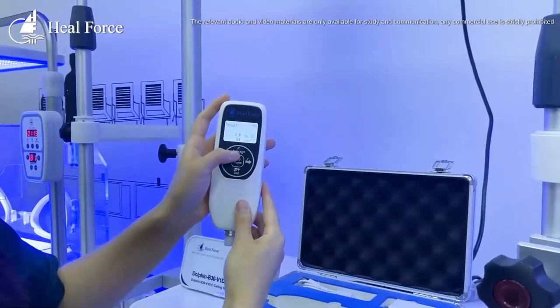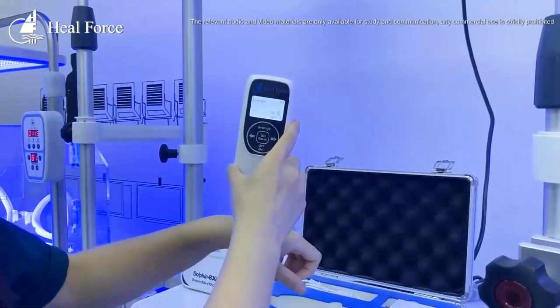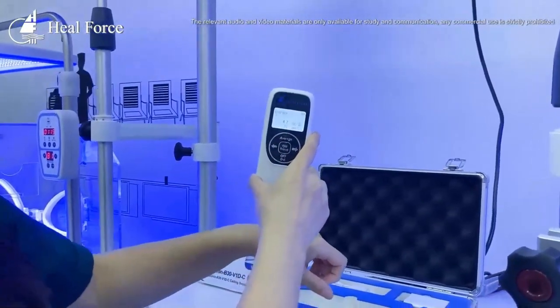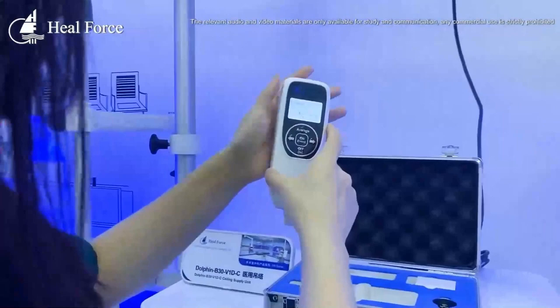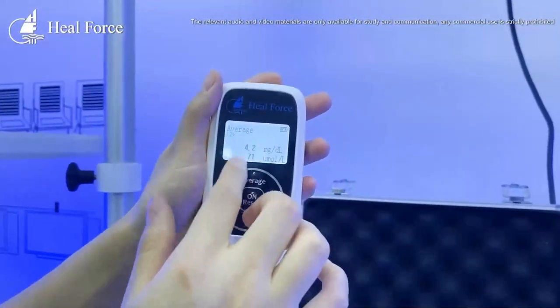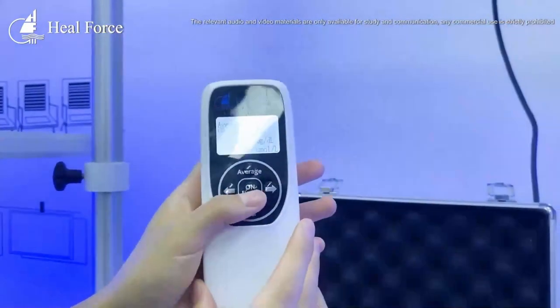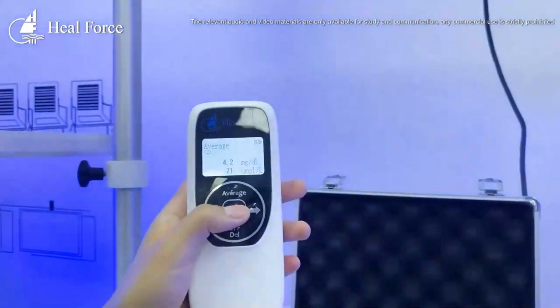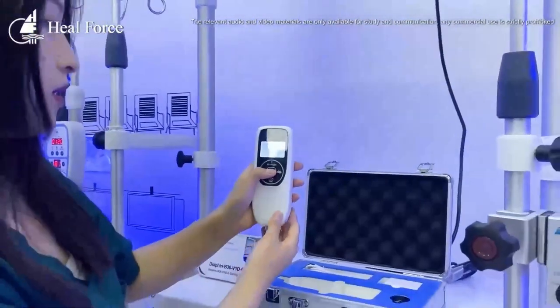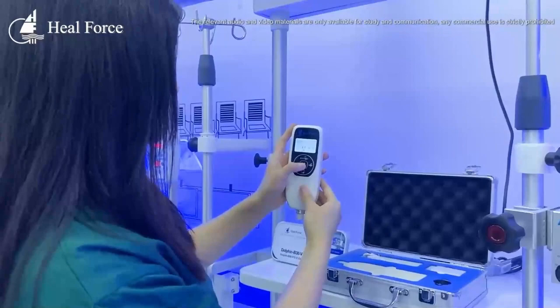We also have the average setting. You can test once, twice, and these numbers are the result of the two testings. This makes it easy for a nurse to check the baby's jaundice value. This is how it works.